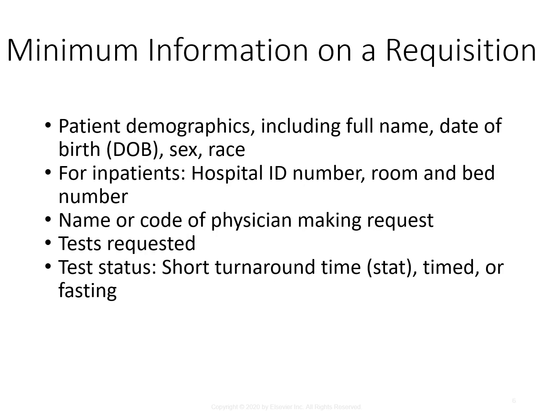All right, so drawing that venipuncture. All blood collection procedures will begin with a request for a test from the physician. That request is going to come through on a requisition, so either it's going to be electronic or sometimes paper still. On that requisition, there is some minimum information that must be on it.